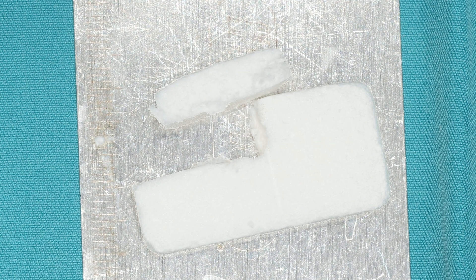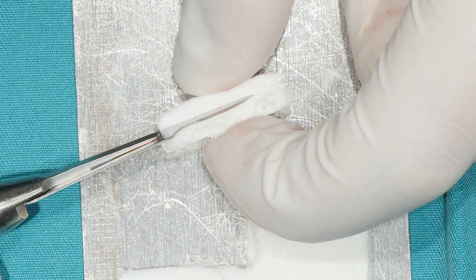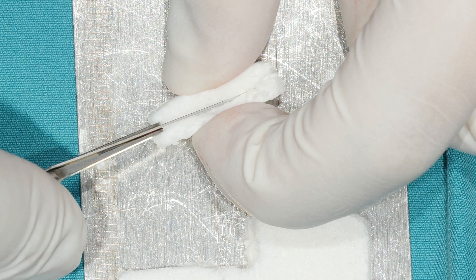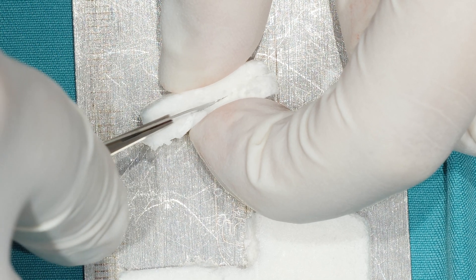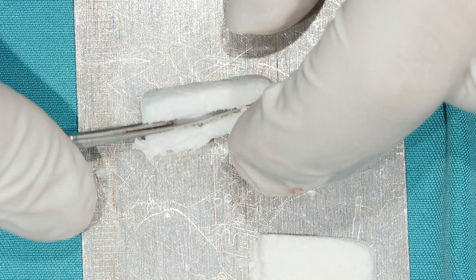What I do is hold the graft on my finger like this, and then I try to split the graft material in half by holding it this way. I think this is the easiest way to adapt the material.